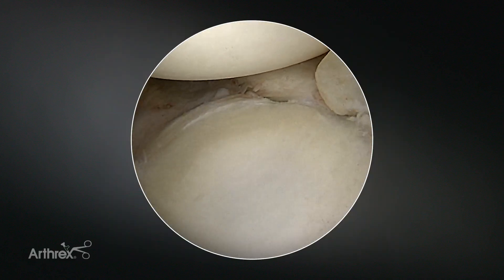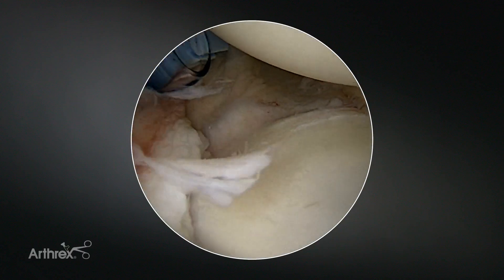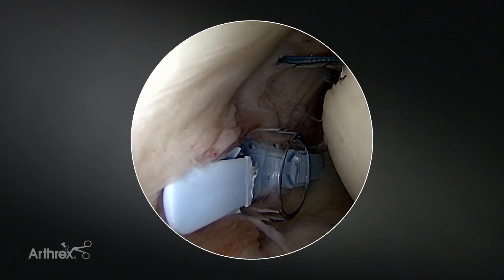Here is our completed Bankart repair. We nicely brought the labrum and the capsule up against the glenoid. The humeral head is already well centered. We have nice tension of the inferior glenohumeral ligaments and now we're going to complete our remplissage.